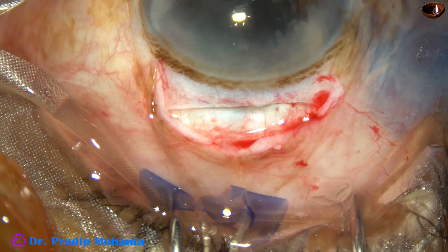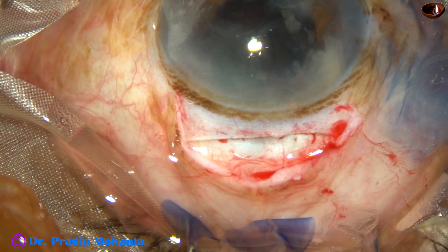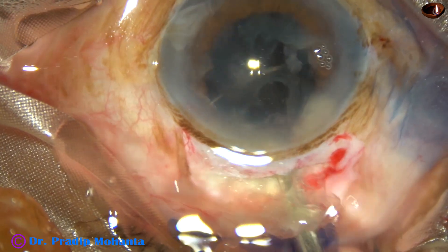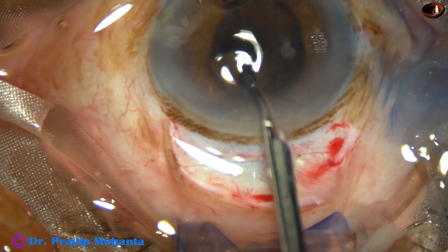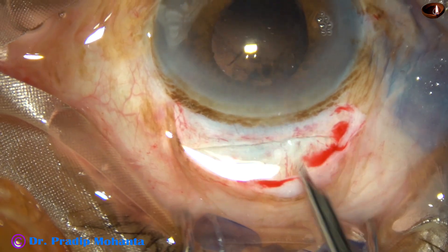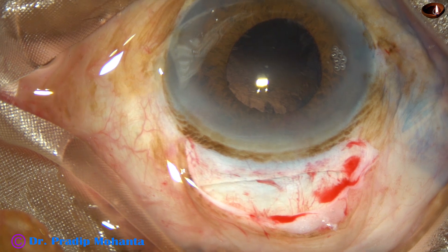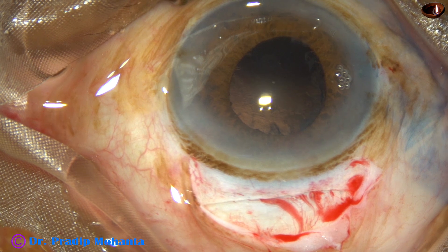Now the epinucleus and some cortex remain and have to be removed. Inject some BSS, depress the posterior lip of the main wound, and the cortex and epinucleus come out. Still, a lot of cortex remains. The pupil has become small, but it is not very small — we can manage.